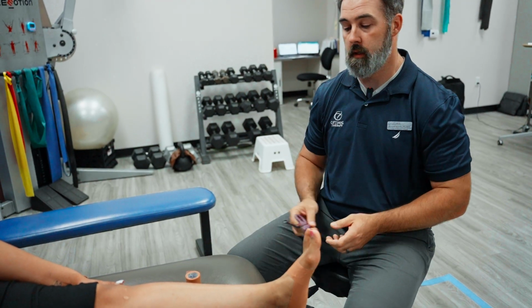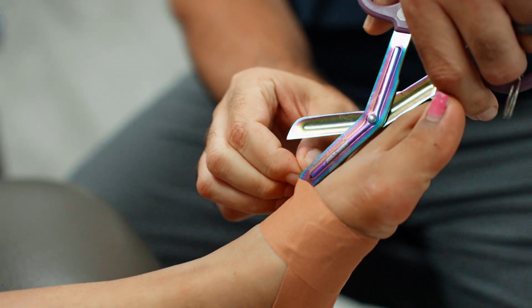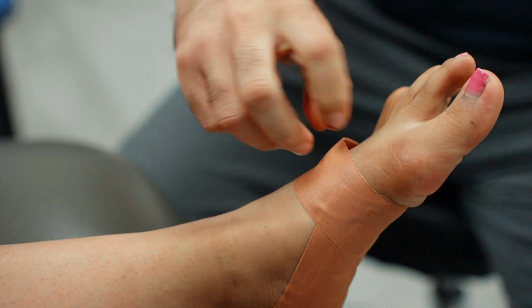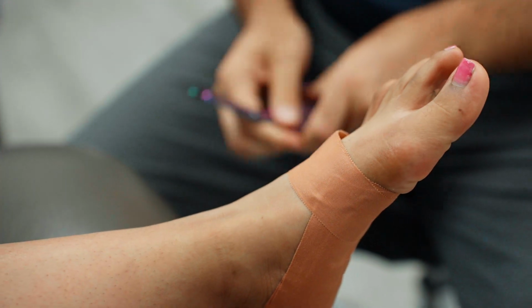To remove it, you want to slide the scissors, and they can be literally any scissors because it's not sticky right here. You can slide scissors up underneath it, snip the tape, and then peel it off.